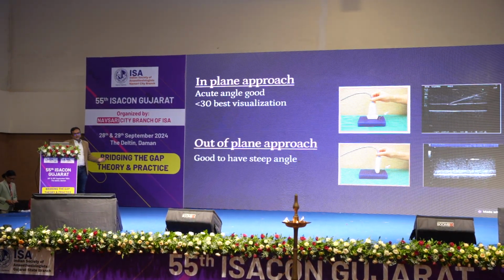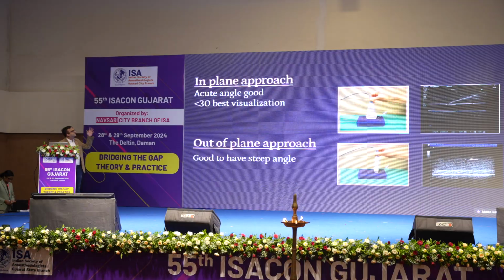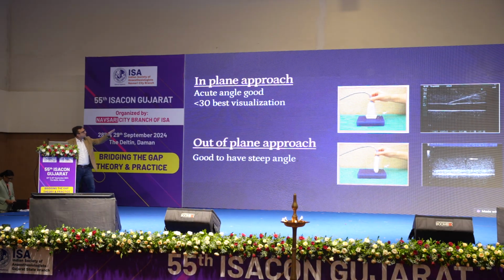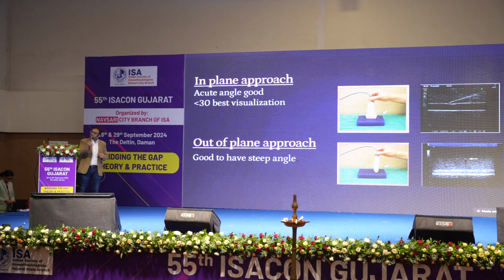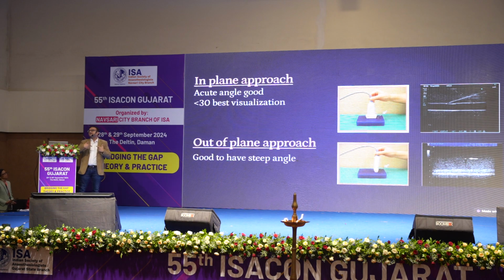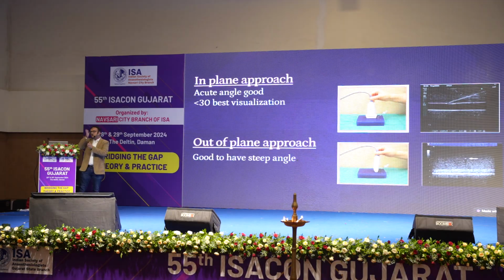Because of the time limit, now after recognizing any structure, we want to go to needling. There are two ways the needling can be done. One is an in-plane approach. Here we will see the whole needle angle. The other is an out-of-plane approach. Here we are just entering. For the in-plane approach, the angle should be less than 30 degrees, as it gives better visualization. Whereas for the out-of-plane approach, it is good to have a steep angle, so you are just remaining nearer to the edge of the probe, as you can see.